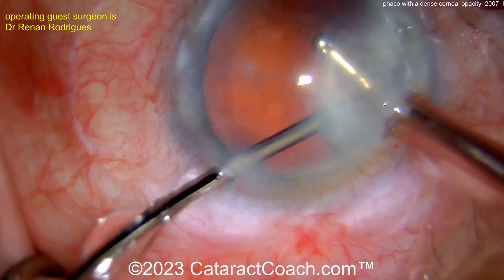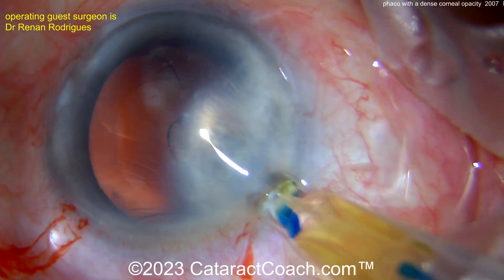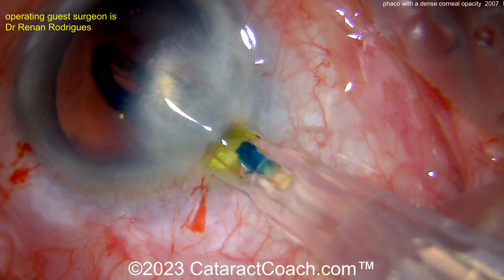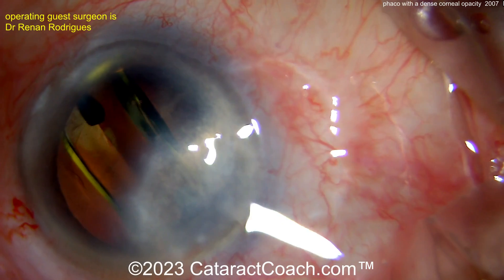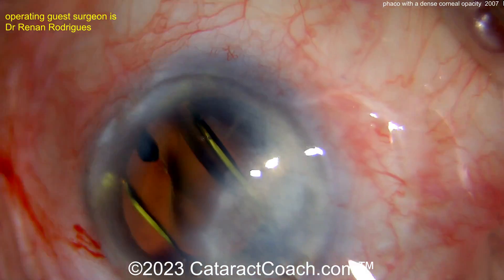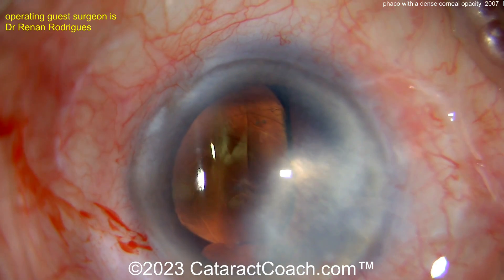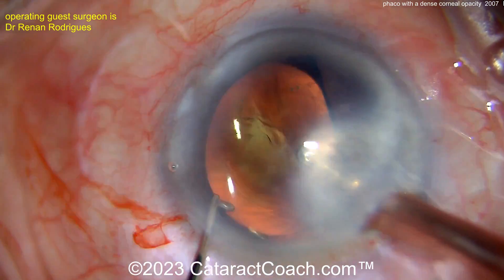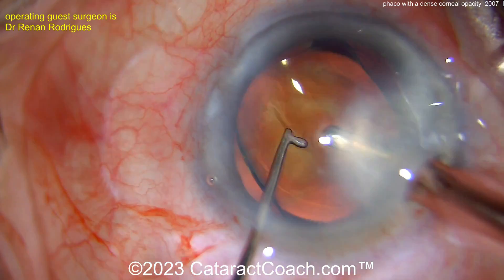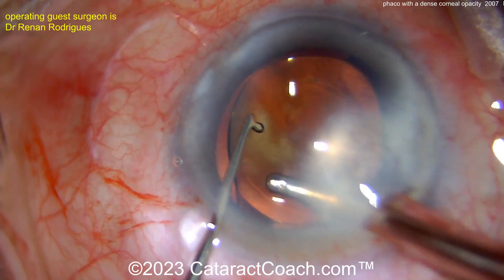Aim for low myopia. I like the bimanual approach here to remove the cortex, especially in the sub-incisional area where visualization is limited. There comes the single-piece acrylic lens going into the capsular bag, making sure it goes in nicely. Beautiful result. Now take out the viscoelastic and finish up the case. This is a tough case — the tough part is not that the cataract was super dense, but rather that visualization is so poor because of that corneal scar.